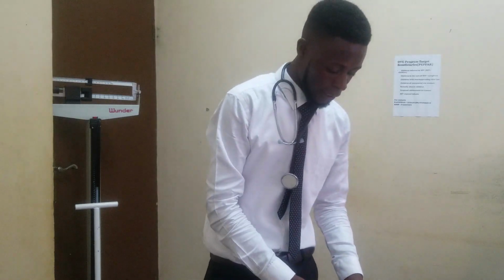after drying you insert it. Patient's details should be placed there. Then you seal. Like I've said, everything comes with a seal. You seal it. You seal here, here, here, here. You make 3 seals.